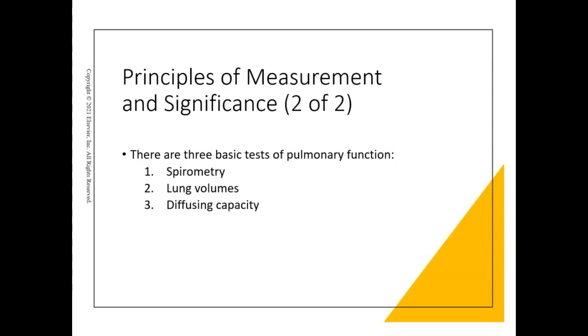So now we're going to really start talking about the individual tests and measurements for PFT, as we've kind of covered infection control, quality, and the physiology. But now let's actually get into the tests. There are three basic tests with pulmonary function: spirometry, lung volumes, and diffusion.